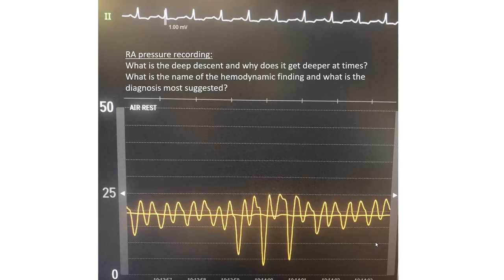And why does this happen? During inspiration, you have increased venous return to the right heart, which causes a propensity for the V wave to rise and the Y to become deeper. The bigger the V, the deeper the descent in early diastole via the Y descent. The V wave may not rise dramatically because the direct effect of negative thoracic pressure gets superimposed on that rising V wave, preventing it from rising in absolute value. But you will get a deep Y descent.